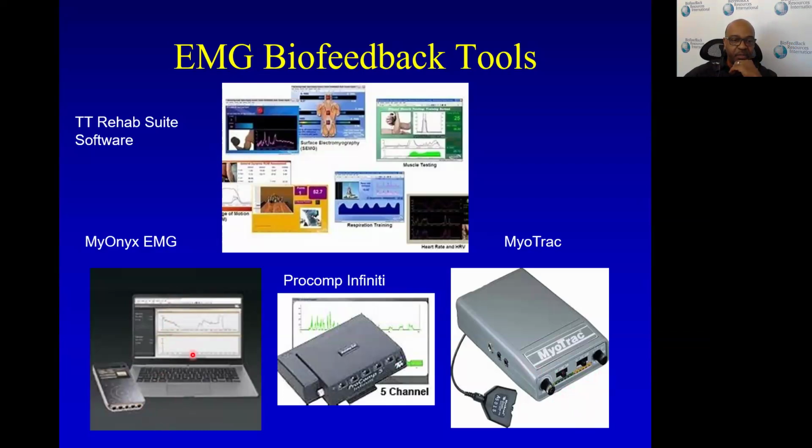EMG that works either with a computer or a tablet with an app. The Thought Technology Rehab Suite is for doing multiple channel EMG work. And then, there are other devices that we could talk about. If anyone has questions on those, I'm happy to talk with you about it.